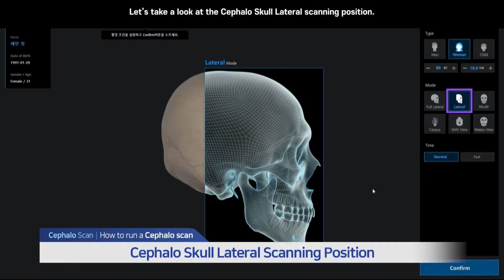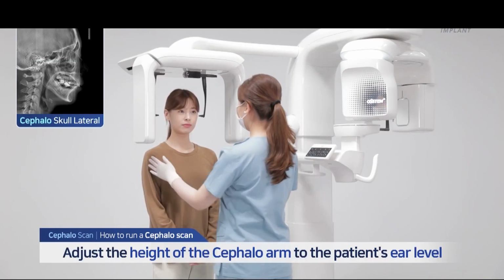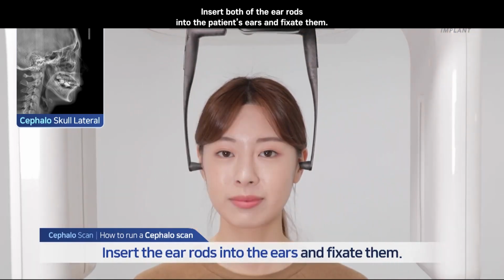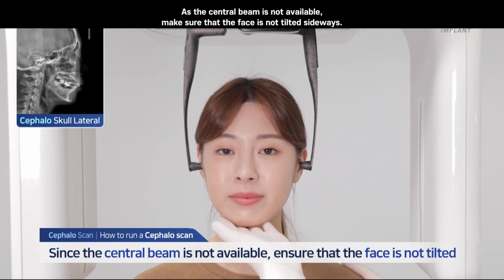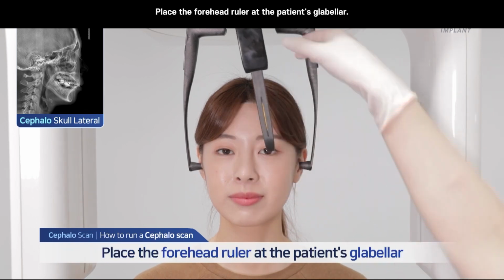Let's take a look at the cephalo skull lateral scanning position. Adjust the height of the cephalo arm to the patient's ear level. Insert both of the ear rods into the patient's ears and fixate them. As the central beam is not available, make sure that the face is not tilted sideways. Place the forehead ruler at the patient's glabellar.